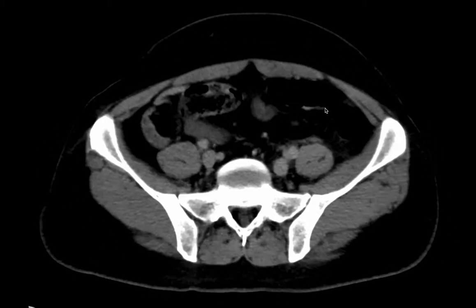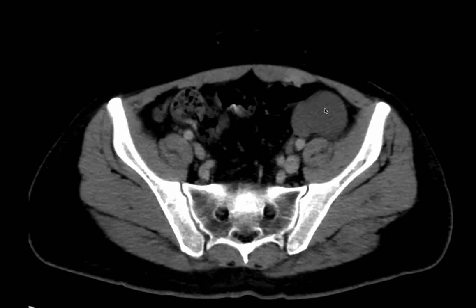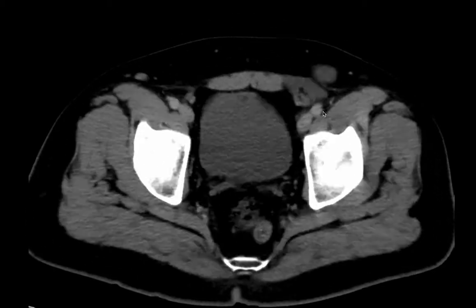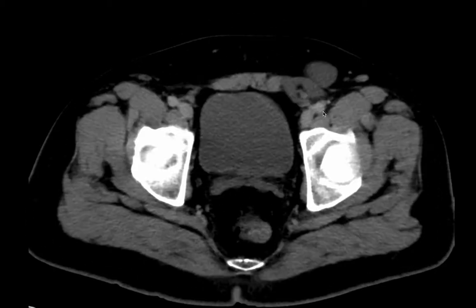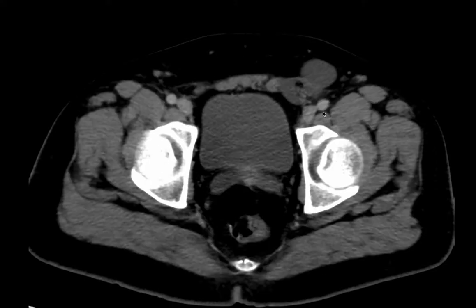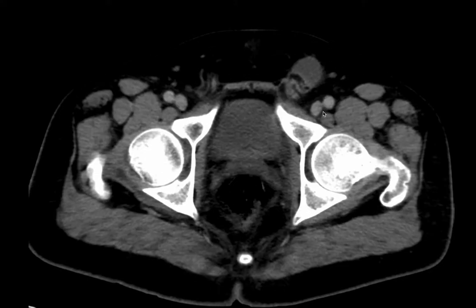There are also discrete lesions along the internal iliac groups, extending to the external iliac groups.